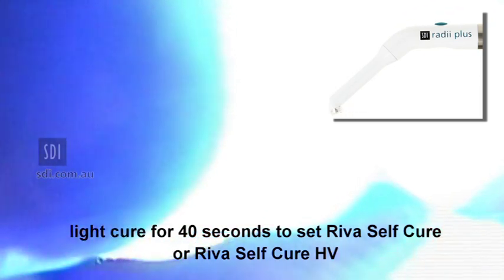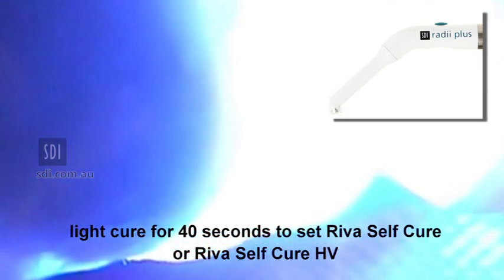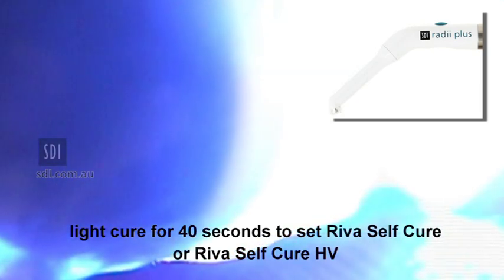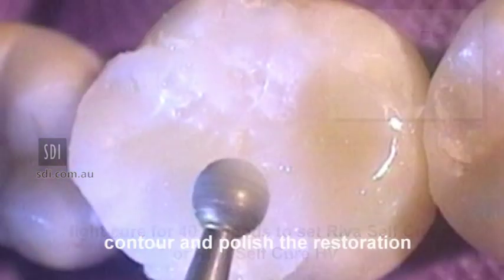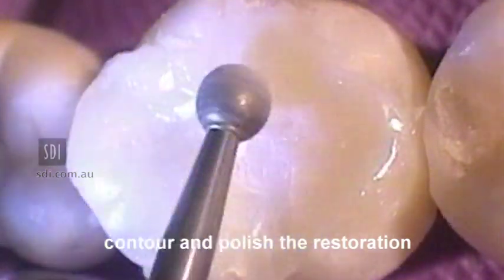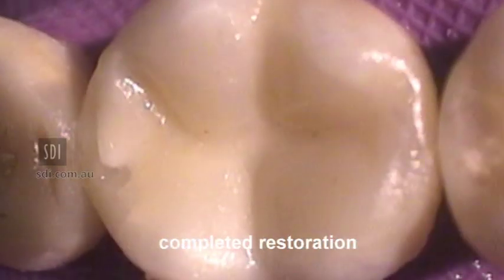Light cure the restoration for 40 seconds to enable the exothermic setting reaction of the composite resin to set the Reva SC or Reva SC HV. Contour and polish the restoration with suitable rotary instruments. The completed restoration.